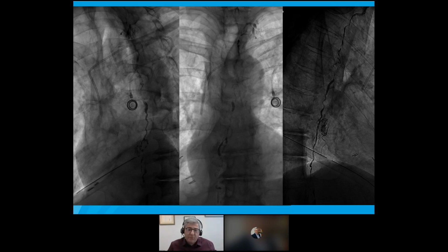This patient presented with some refractory chylothorax despite already two surgical reinterventions. When we opacified the thoracic duct here in the lateral view, you can see indeed that the thoracic duct is nicely patent. However, here in the proximal and anterior part of this thoracic duct, you see some leakage, and this was indeed the leak which was responsible for the refractory chylothorax.